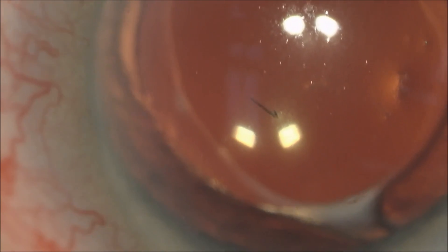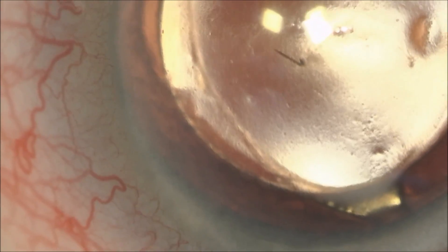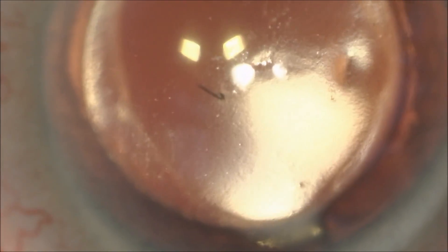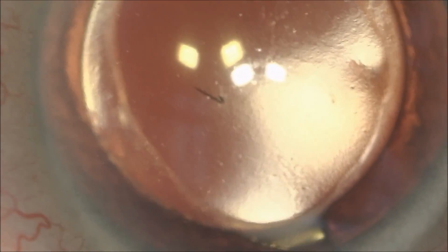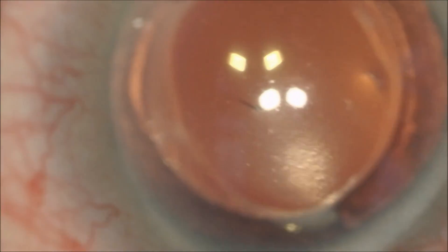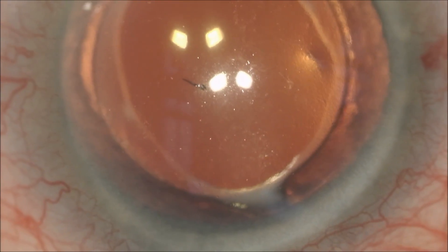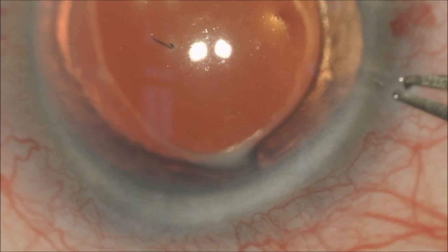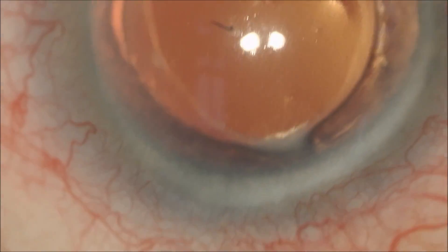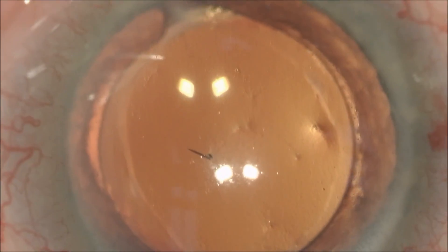You'll see the microscope lights reflected on the cornea. We are going to make two incisions into the front part of the eye using a super sharp blade. You'll see this entering from the left side of the screen to make an approximately 1.1 millimeter clear cornea incision, and this blade will go in parallel to the iris.